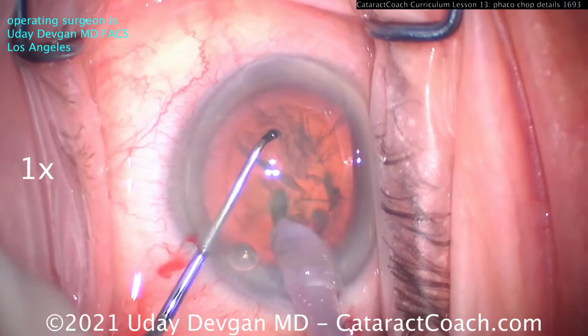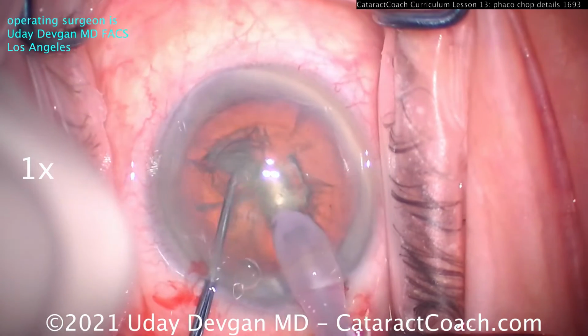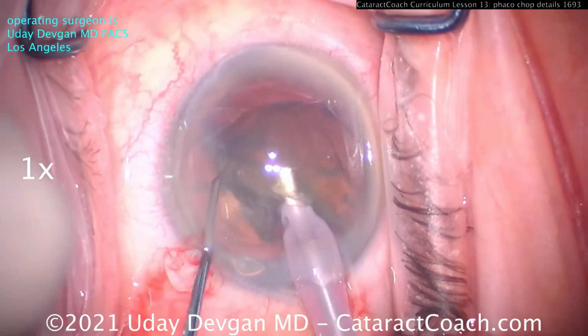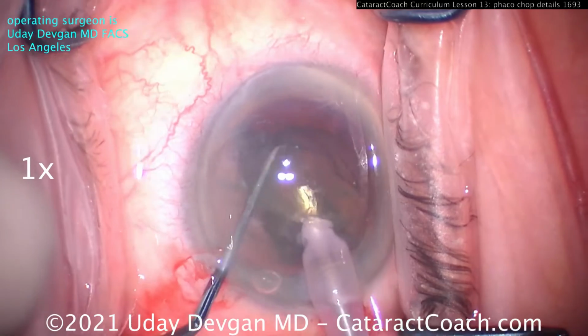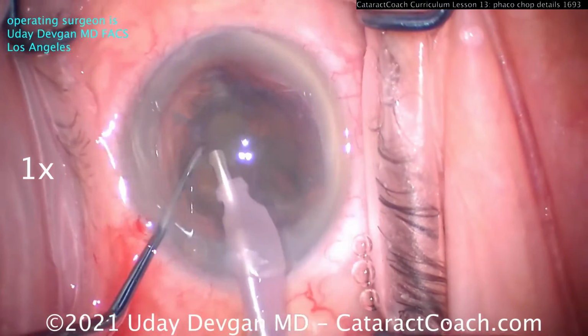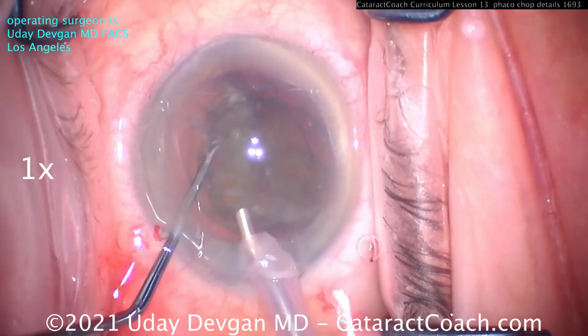Subincisional area, embedded, achieve high vacuum, push the chopper into the nucleus and spread, hold the one half out of the way while you bring up the second half. And now we can go around and chop it. And I want to show you the complete nucleus removal before we get into the slow motion.